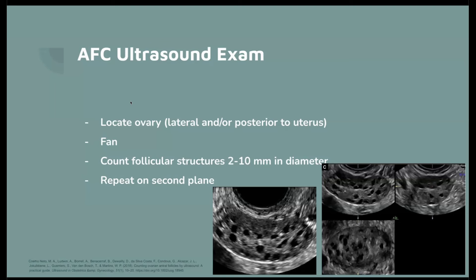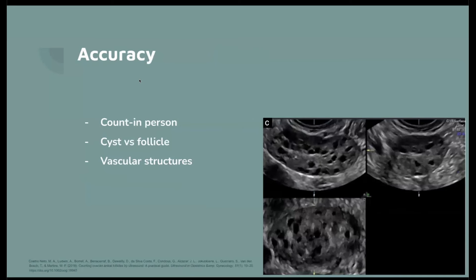It's important to repeat the count on the second plane — get the best view on the first plane, count, then repeat on the second plane to verify. The accuracy of AFC can be tricky since you're counting small dark structures. The best way to increase accuracy is to count in person. Even though videos of fanning through the ovary can be helpful in telehealth settings, when you're in person you can better differentiate between a follicle and a cyst, and can use Doppler mode to differentiate vascular structures. In person, if you slightly probe the structure and it moves with the ovary, it's a follicle; if it doesn't move, it's more likely a cyst.